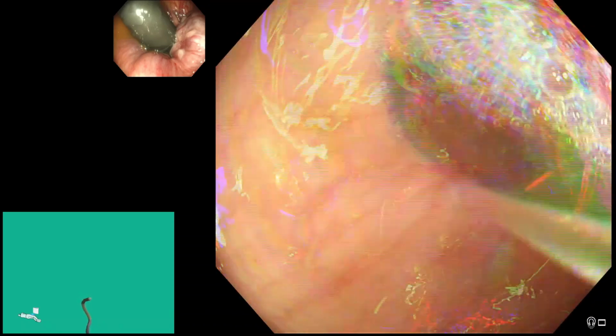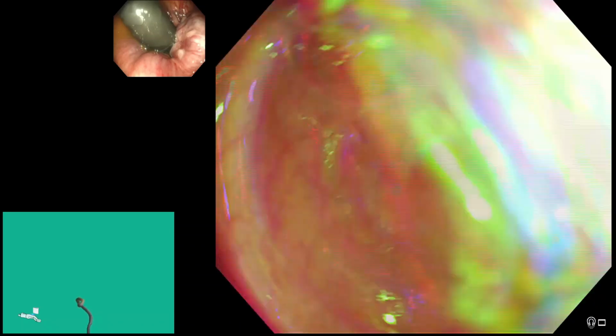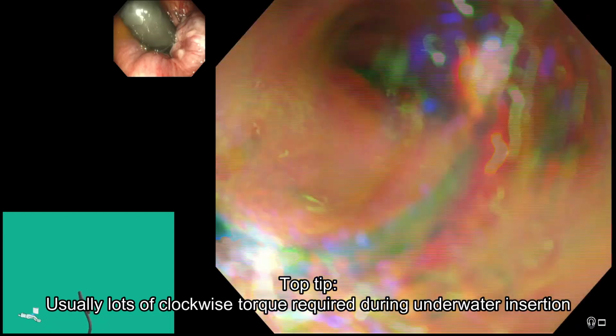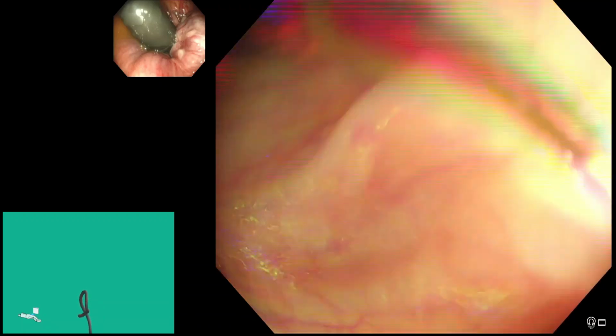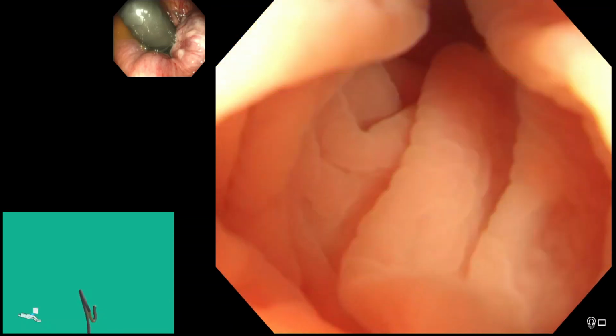So we're just on to the sigmoid now, and you do a lot of clockwise torque with water insertion, and we're just going over the sigmoid. Usually this is the uncomfortable bit because we're now going into an alpha loop, and you're sucking all the way. That's really important. So you're putting water in continuously. My foot's still on the pedal, and I'm just putting water in as we go.